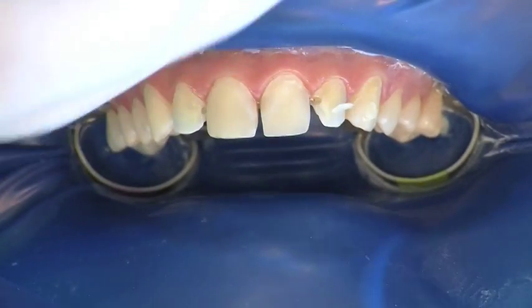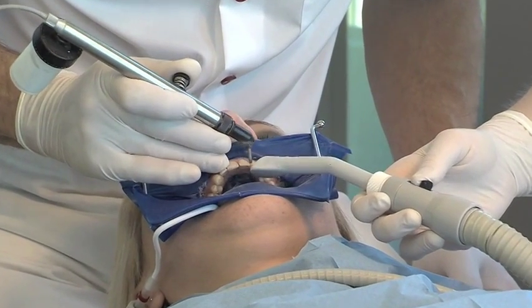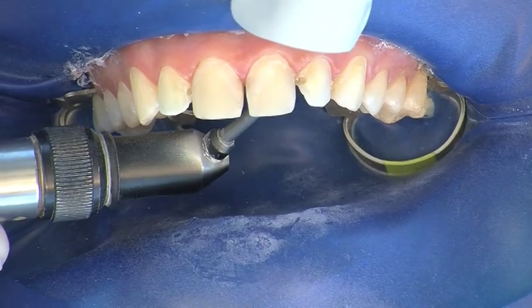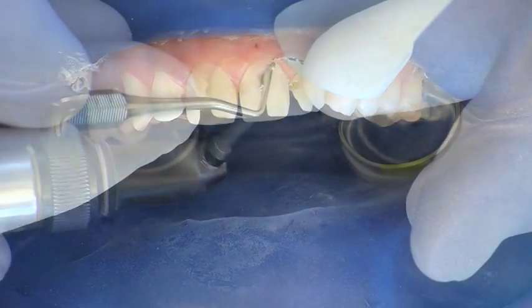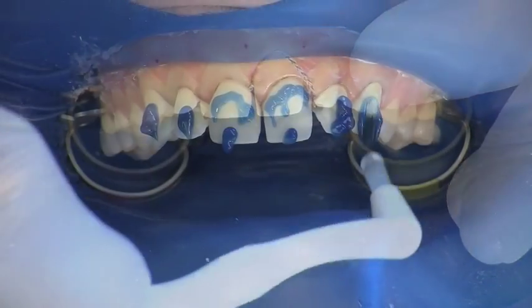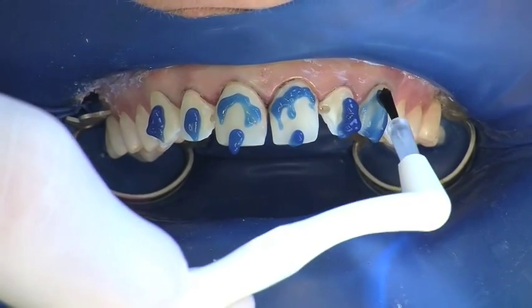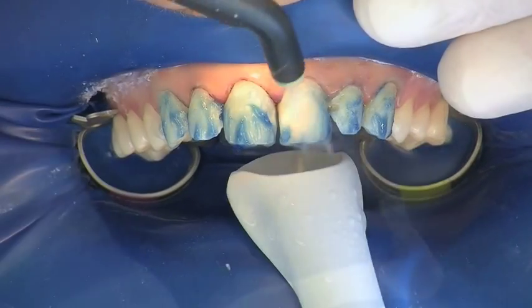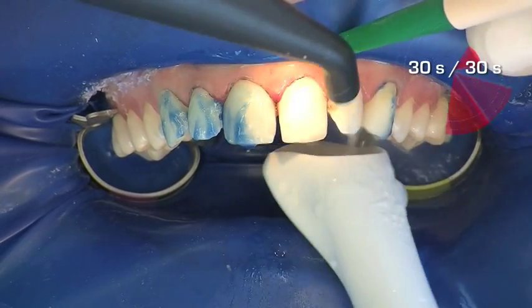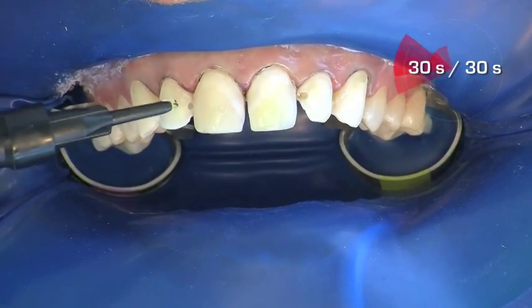The teeth are cleaned after removal of the Componeers and preferably sandblasted to ensure subsequent optimum conditioning. A retraction cord can optionally be placed for improved cervical control. The etching gel is applied to the teeth and distributed to all surfaces using a brush. After 30 seconds, the gel is thoroughly sprayed off for 30 seconds and air dried.